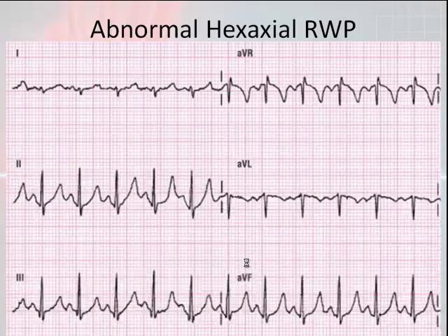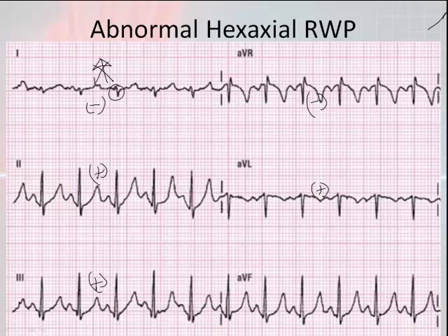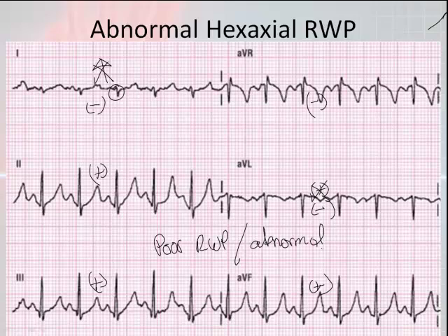Let's look at an abnormal R wave progression. In lead 1, you're supposed to be primarily positive, but you're not — you're primarily negative. Lead 2 is positive, lead 3 is positive, AVR is primarily negative, AVL is supposed to be primarily positive but it's negative, and AVF is primarily positive. This would be considered a poor — or abnormal — R wave progression.